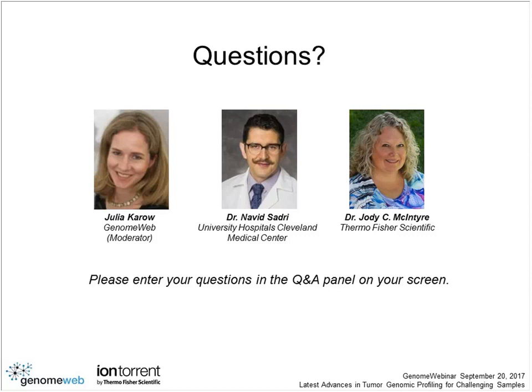Okay, thank you. Question for Dr. McIntyre. What is the time to result once a biopsy is received and a report is sent to the clinician? So, good question. I think Dr. Sadri mentioned his turnaround time was less than a week. Actually generating the report in Oncomine Knowledge Base Reporter happens in seconds.